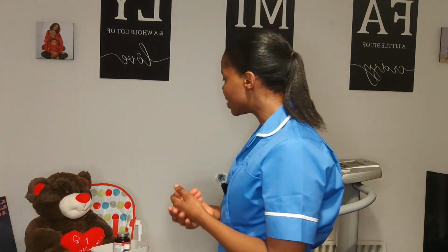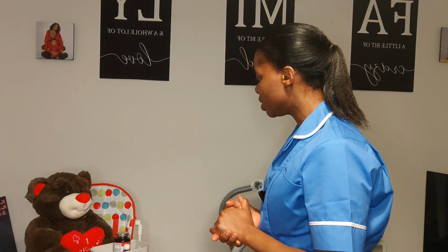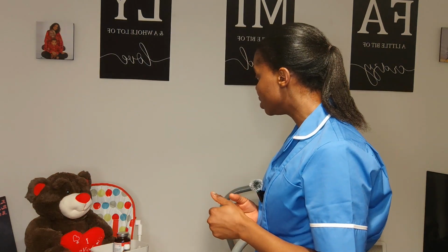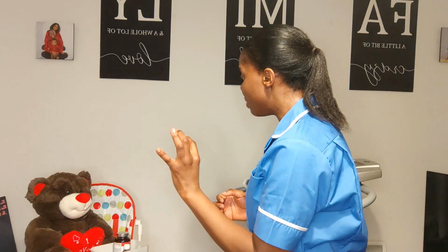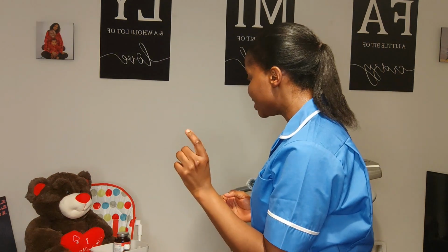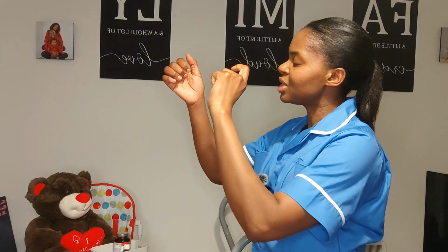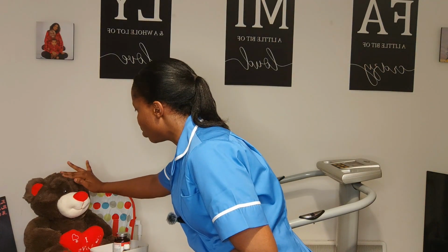All right, Janet, is it okay to assist you to sit up in an upright position, please? All right, thank you very much. Okay, can I confirm if you can hold your breath for 10 seconds and more? Oh, fantastic. Okay, I'm going to be putting this spacer into your mouth. I want you to form a tight seal around it. Okay, so I'll go ahead and shake my salbutamol 2 to 5 seconds. All right, I will attach that to the end of the spacer device. Okay, I'll be tilting your head slightly backward now.